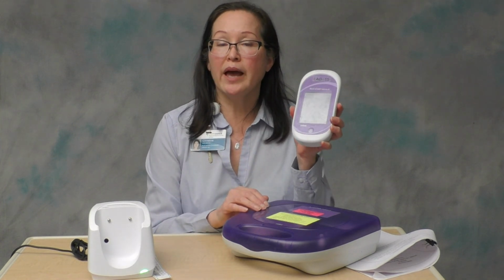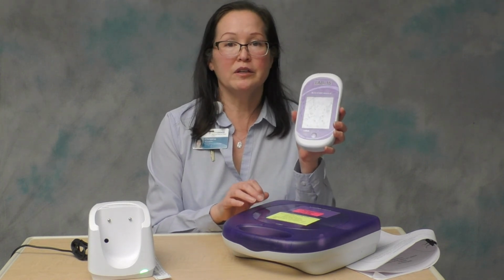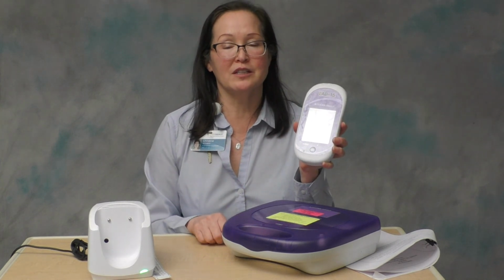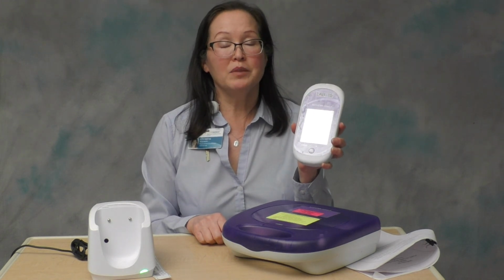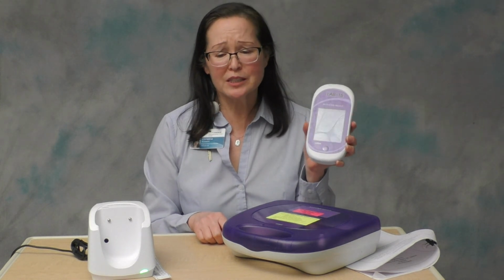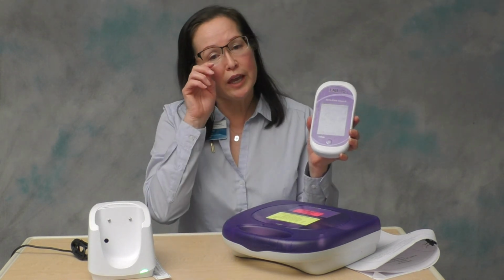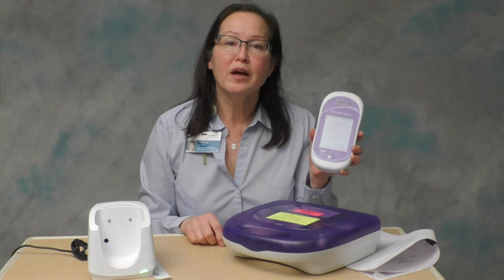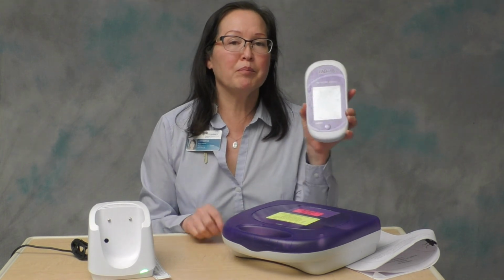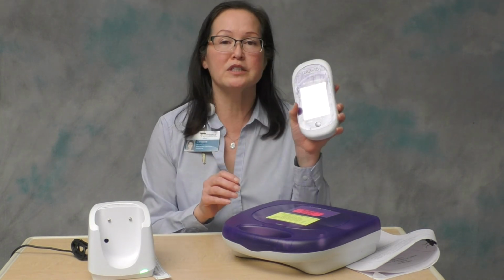The meter gets cleaned after every patient test, regardless of whether or not there is a meter in every room for every patient. So, for example, in our intensive care units, each patient room has its own meter. That does not mean that you do not clean the meter after every patient test. Sometimes the meters don't communicate and we have to go up and do troubleshooting on them.